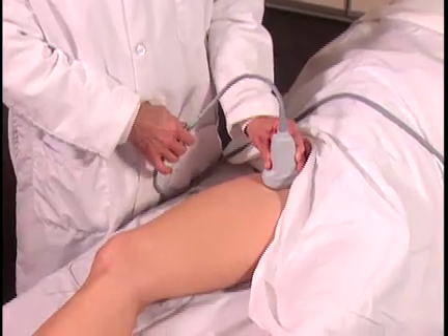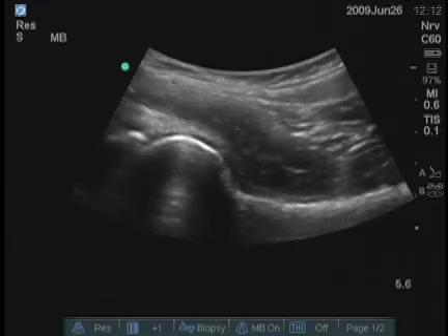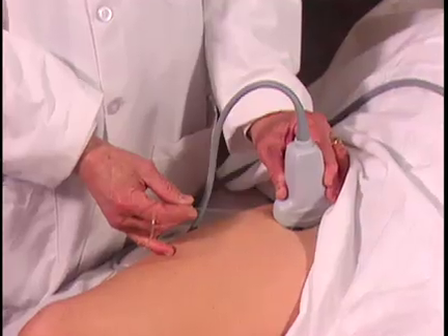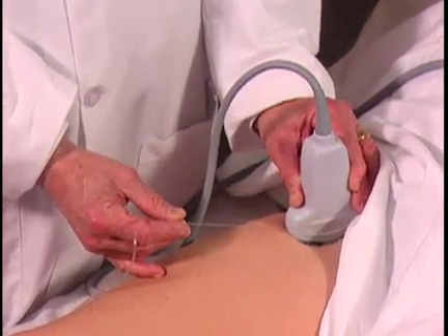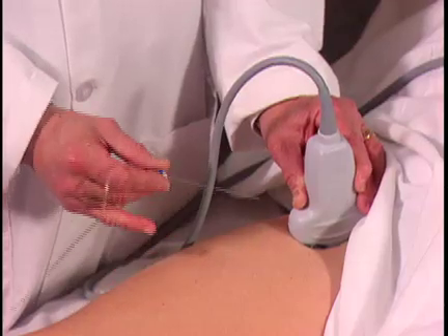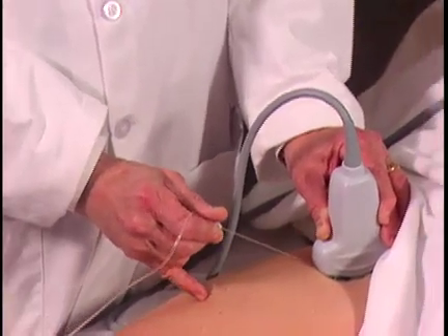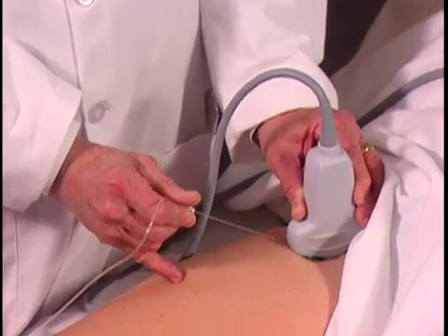The orientation will be the same as demonstrated previously. The image on the screen is the same as we've seen before, with the femoral neck being the target area. What I would do is mark with an indelible pen close to the transducer, cleanse this area, anesthetize it, and insert the needle at approximately this angle, parallel to the transducer, so that the needle is as visible as possible.